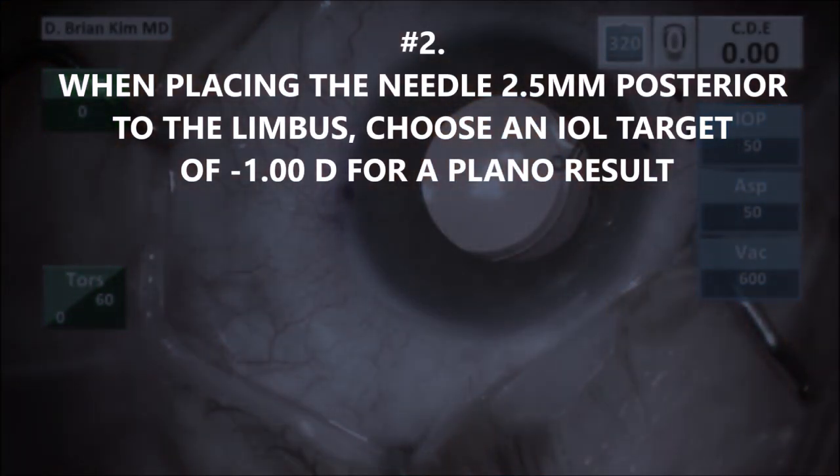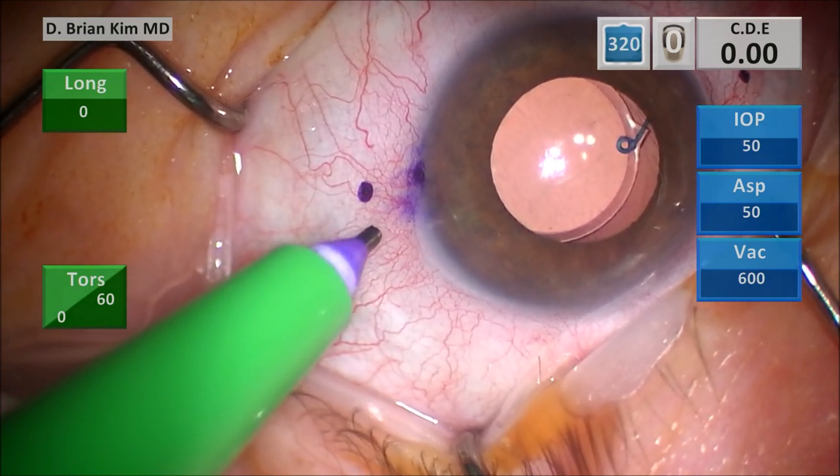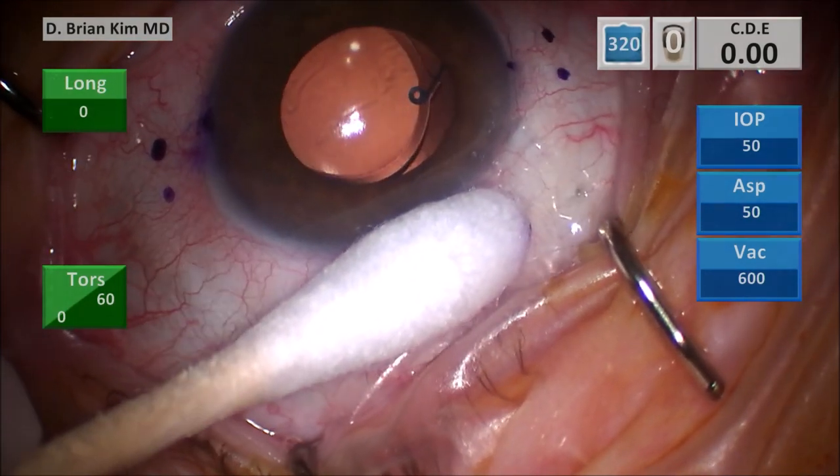Number two: when placing the needle two and a half millimeters posterior to the limbus, I choose an IOL target of minus one diopter for a plano result. Because I like to go two and a half millimeters back, you have to make this refractive adjustment. Why do I go two and a half millimeters back? Because in my experience, this reduces the chances for IOL-to-iris contact, reduces the risk for UGH syndrome, and reduces the risk for optic capture as well. Going ahead and marking the other side — two and a half millimeters posterior to the limbus, then two millimeters adjacent. I'm using the cotton tip to turn the eye and indenting with the trocar four millimeters posterior to the limbus.